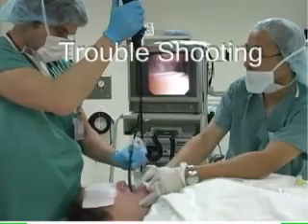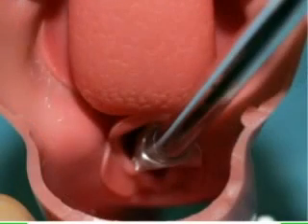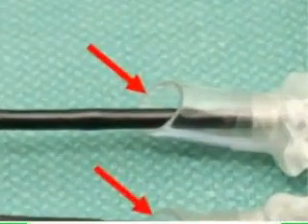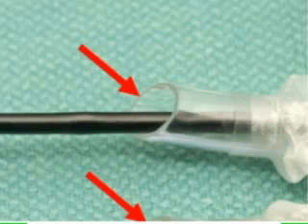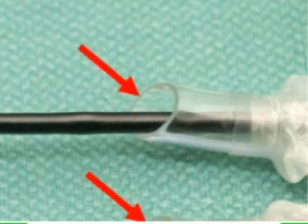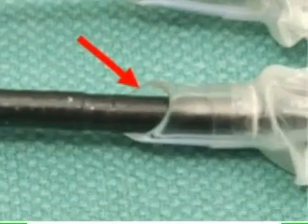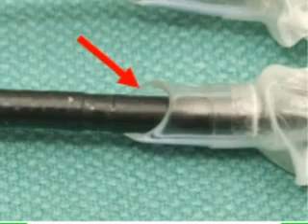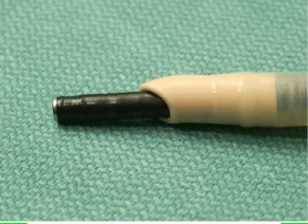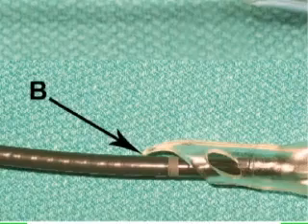Difficulty in passing the ensleeved endotracheal tube through the larynx may be encountered. Rotation of the tube 90 degrees counter-clockwise may improve passage of the tube through the larynx. The larger the discrepancy between the outside diameter of the bronchoscope shaft and the internal diameter of the ensleeved tube, the greater the chance that the tube may impinge on laryngeal structures. Therefore, this discrepancy should be minimized if at all possible. Laryngeal cannulation may also be facilitated by using a tube with a modified tip design, such as the intubating LMA tube with a soft hemispherical bevel or the Parker flex tip tube.